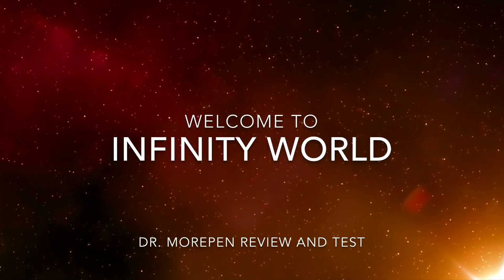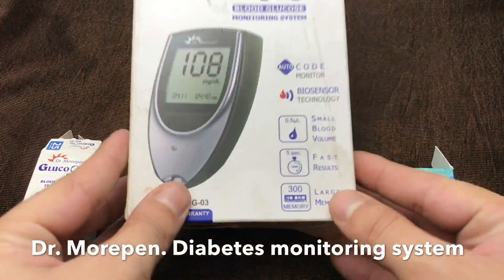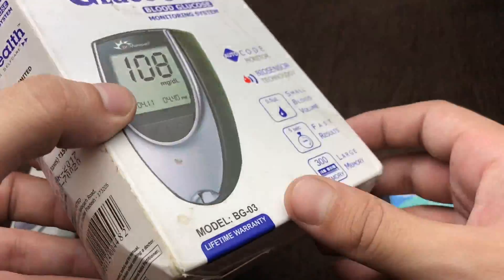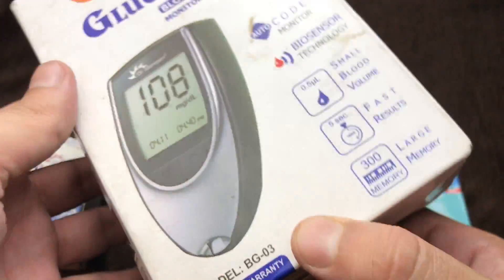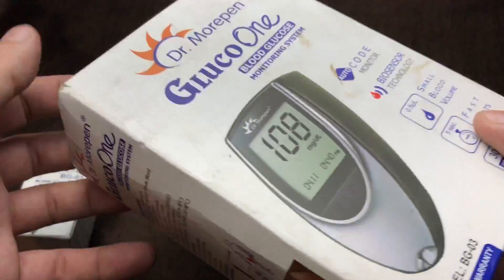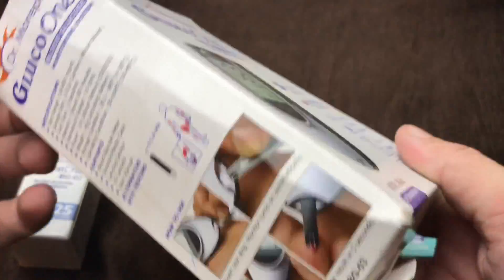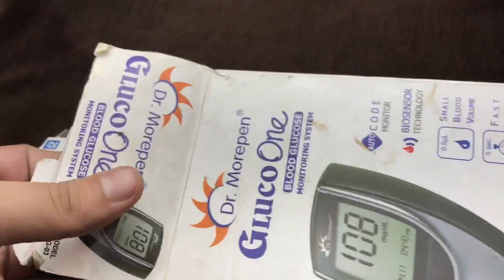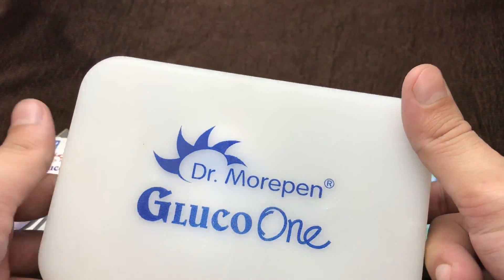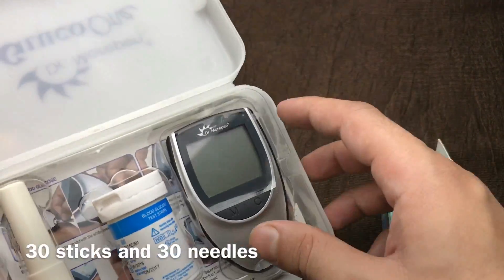Welcome to Infinity World. Today I'm going to explain how you can use the Dr. Morpen Gluco-1, model number BG03. Sugar diabetes is a worse disease, so take care of your health first. This is a monitoring machine and there is some information like MRP, expiration date, and how to use it. It's very easy to use, not that difficult. Let's see first what we are getting in the box.